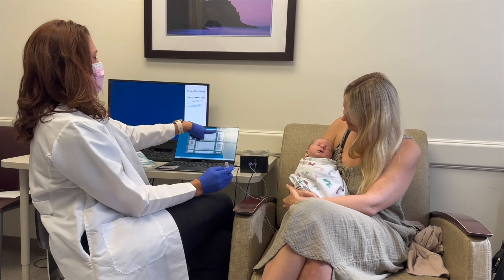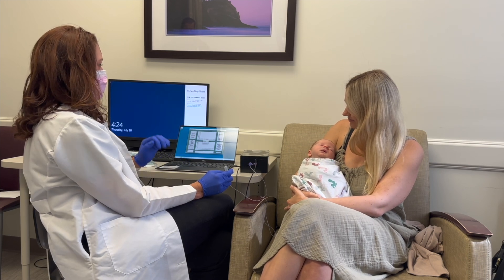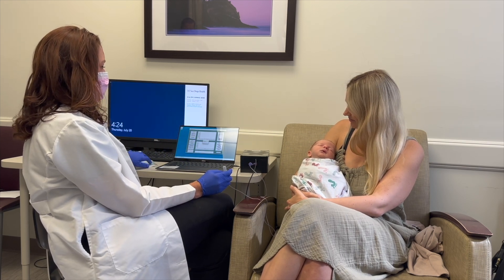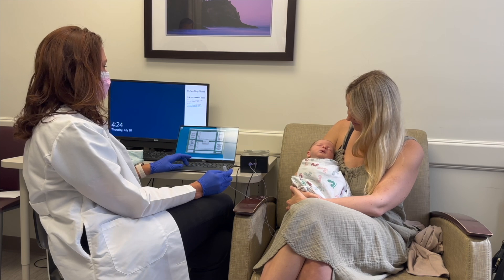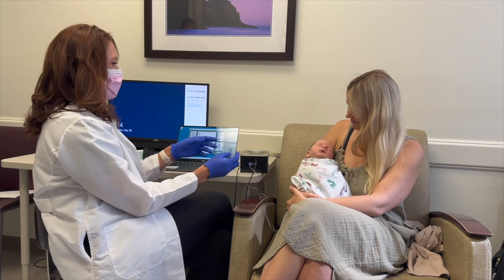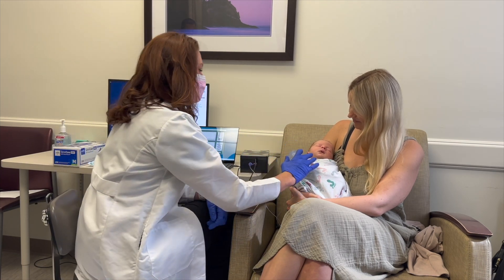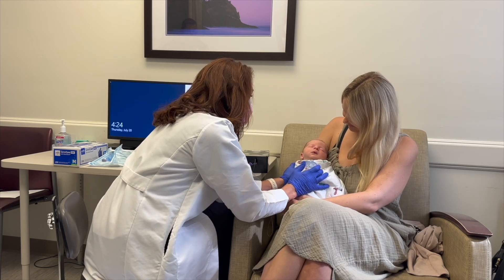Over here under experiment, we'll just press to start, and it confirms which patient you have, which type of pacifier, and if there was any intervention, and it will get the timer going.